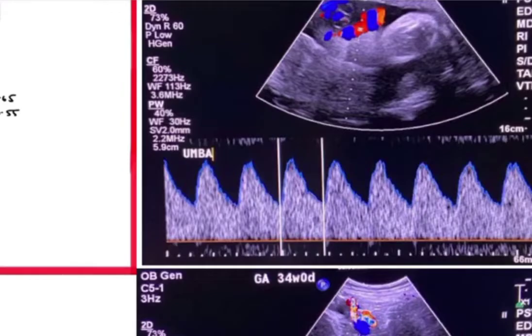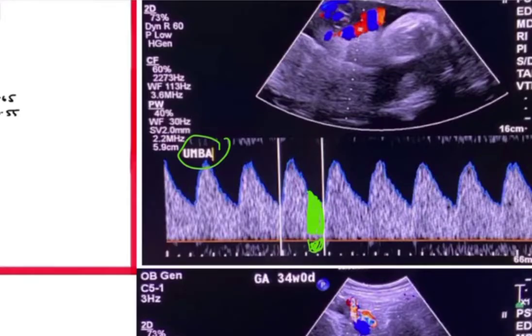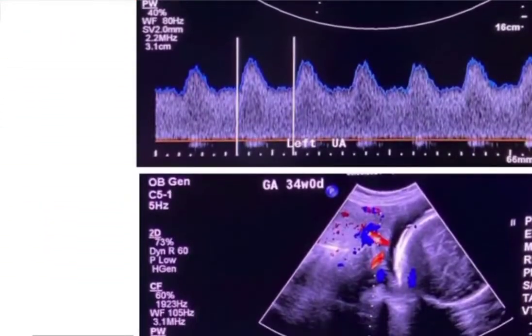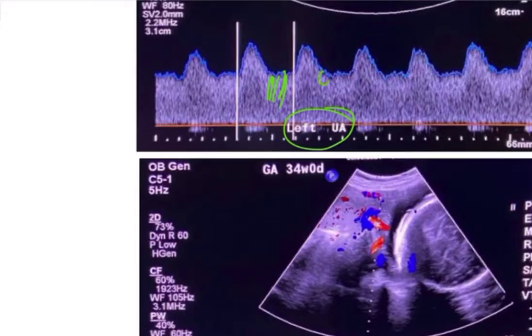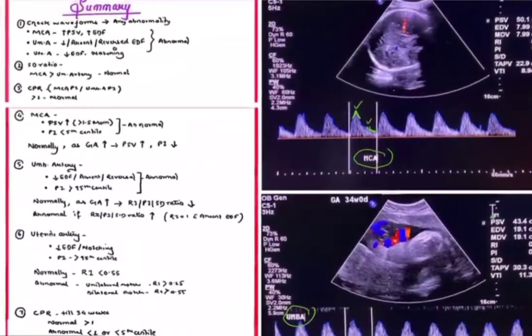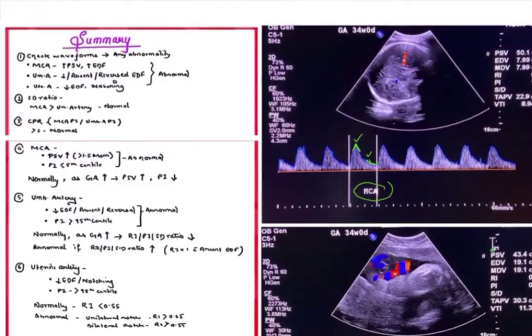Next, for the umbilical artery, check the waveform for end diastolic flow — is there any reduced, absent, or reversal of the umbilical artery flow? For the uterine arteries, you should look for reduced end diastolic flow and early diastolic notching. Both are abnormal. So just from the waveforms, we can detect abnormalities: for MCA — raised PSV and raised end diastolic flow; for umbilical artery — reduced, absent, or reversed end diastolic flow; for uterine artery — reduced end diastolic flow or early diastolic notching.